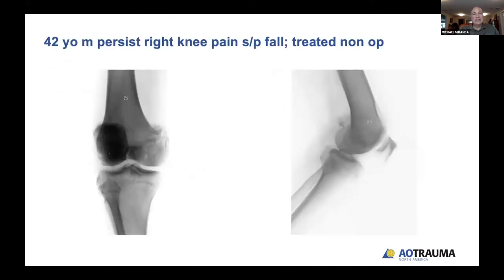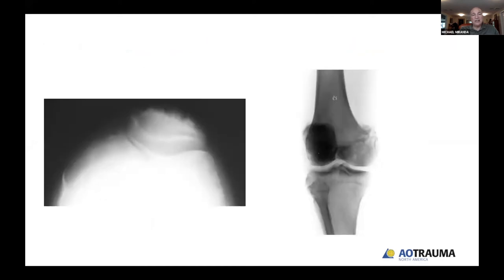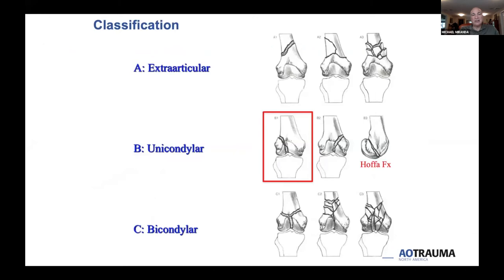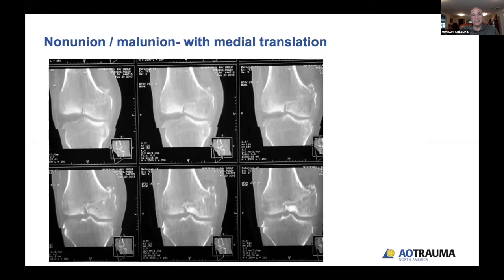Case: a 42-year-old, status post a fall, presenting with knee pain. Initially managed non-operatively, the initial radiographs show some deformity of the medial condyle and callous formation along the medial adductor tubercle. Callous formation in the metaphysis is notable — it often means either bone grafting at some point or a nonunion. On sunrise view, the fracture extends across the joint, characterizable as a unicondylar nonunion-malunion, confirmed on CT. It's not uncommon to see a nonunion component with malunion.